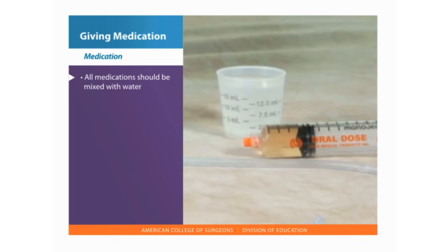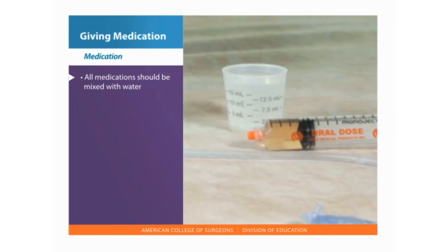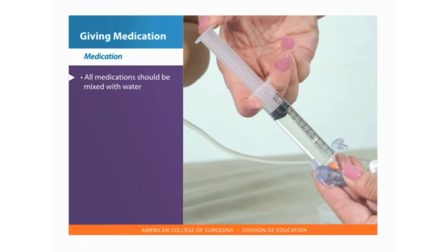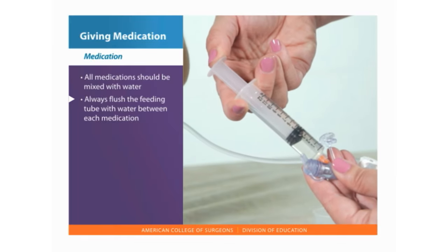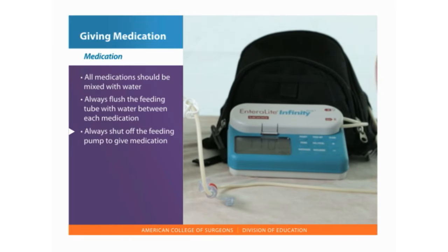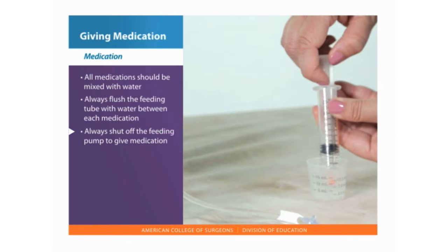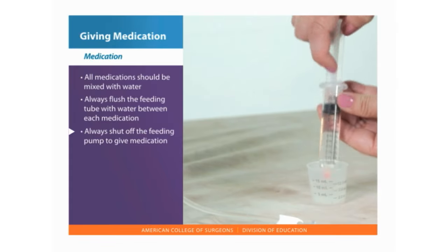All medications should be mixed with water so they will be easier to insert into the feeding tube. If more than one medication is needed, always flush the feeding tube with water between each medication. Always shut off the feeding pump to give the medication. Some feedings may interfere with the medication. Flush after the medication with the recommended amount of water and restart the feeding.